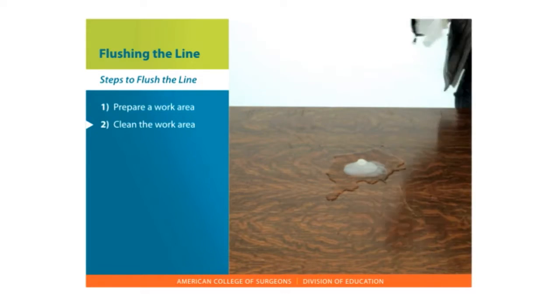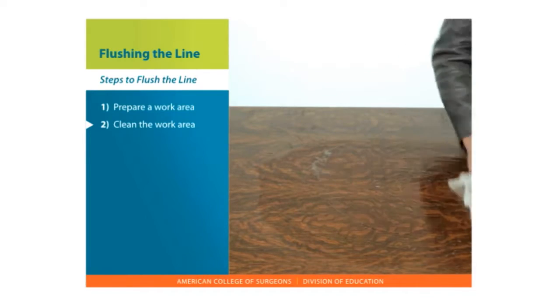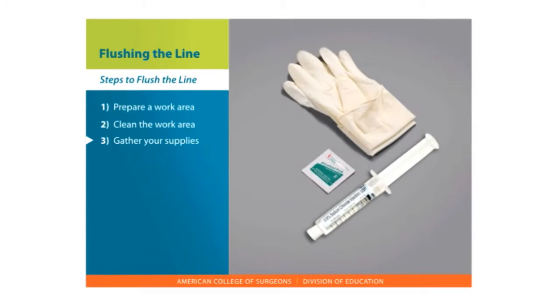Clean the work area with soap and water and dry with a paper towel. You can also cover the surface with a clean towel if it is not washable. Gather your supplies. This will include an alcohol wipe, clean gloves, and medication and fluids for flushing, sodium chloride, or heparin syringe.